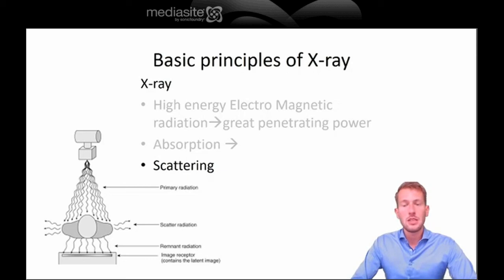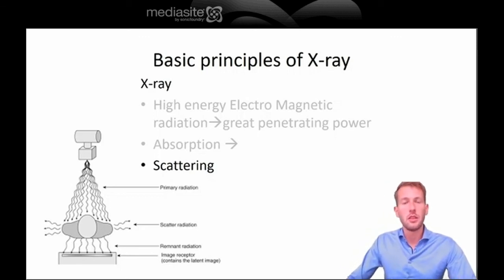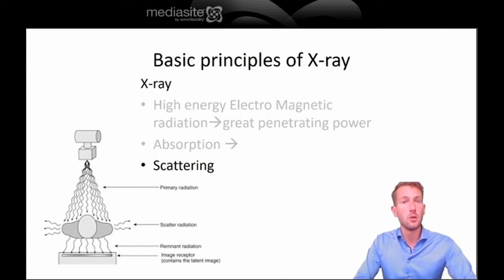Those scattered X-rays are scattered and emitted in all directions, both outside and inside the body. But what does that mean for the patient and for the radiographer and the X-ray itself? Well, the larger the volume that is photographed, the more scattering radiation inside of the patient. Thus, the higher the radiation load dose for the patient.